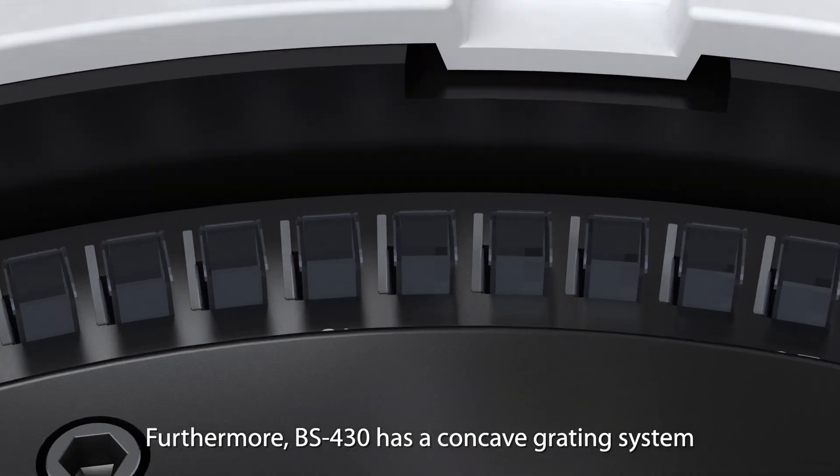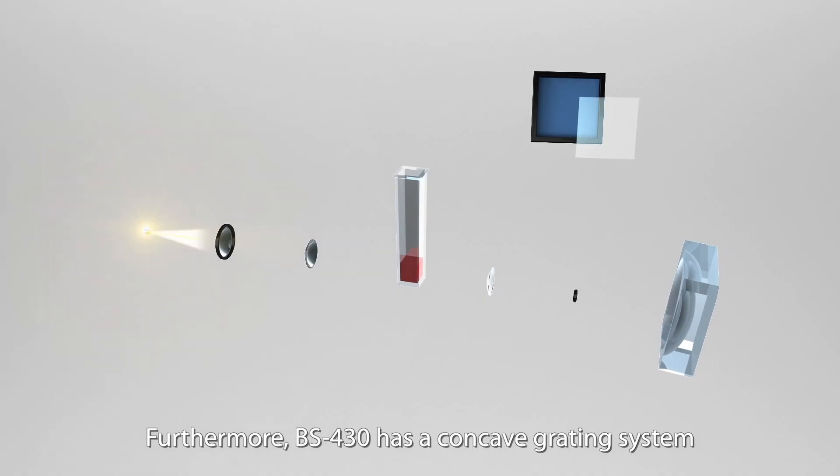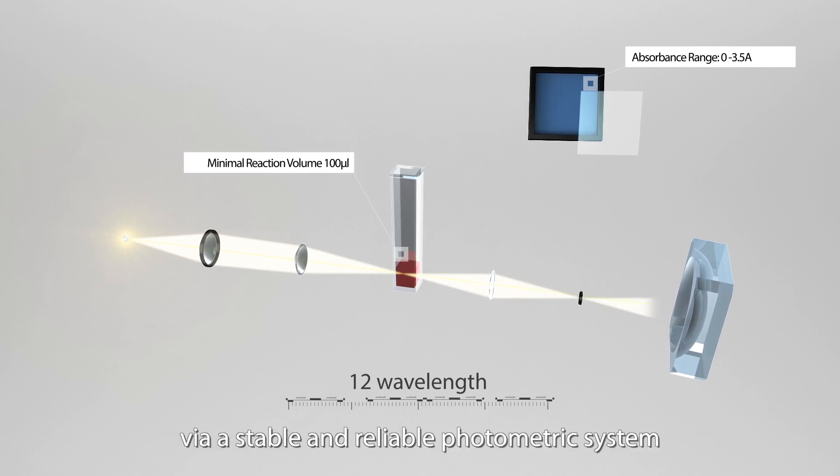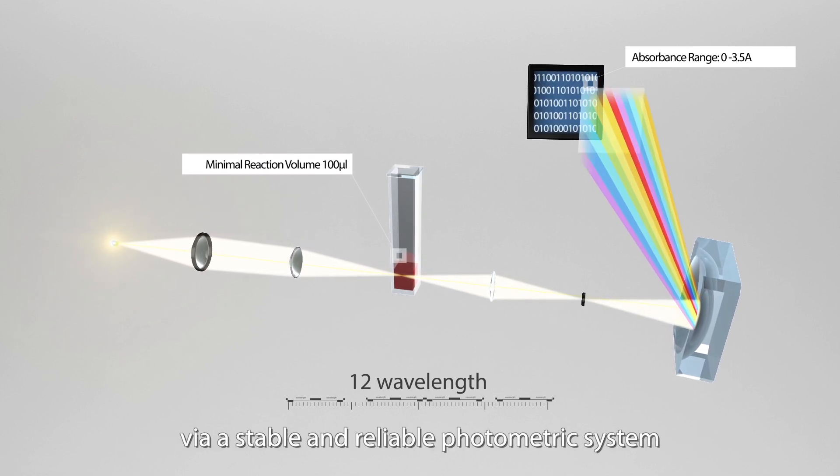Furthermore, BS430 has a concave grating system, providing 12 wavelengths, and ensuring accurate results via a stable and reliable photometric system.